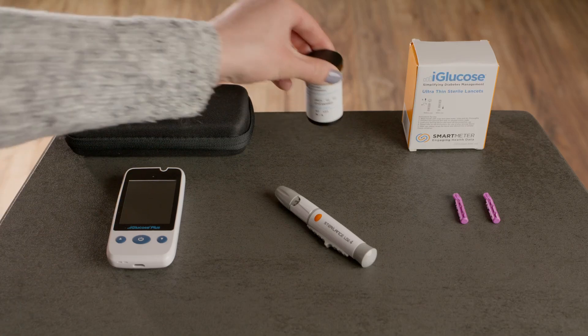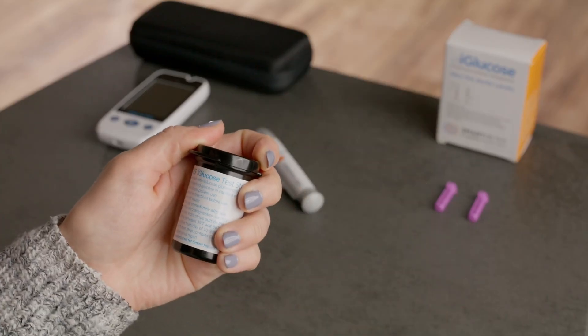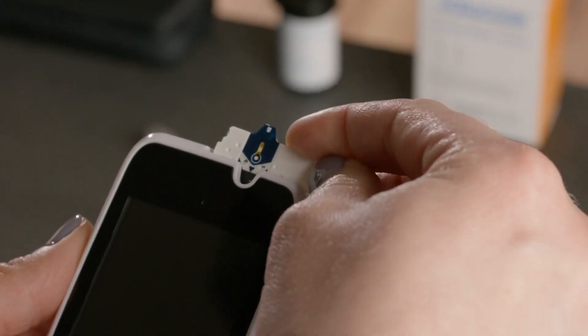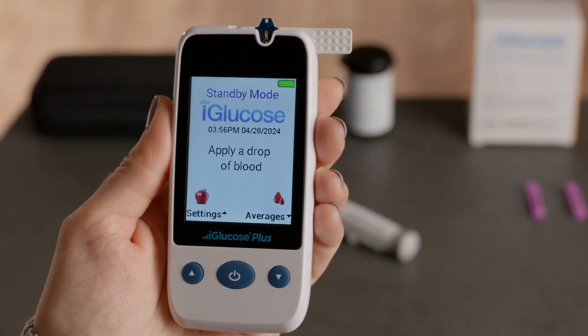Now, take a test strip from the vial and close the cap immediately to keep the remaining strips fresh and sterile. Hold the test strip horizontally with the indicator arrow pointing down and push it into the test strip port. Wait for the "apply a drop of blood" message to appear.